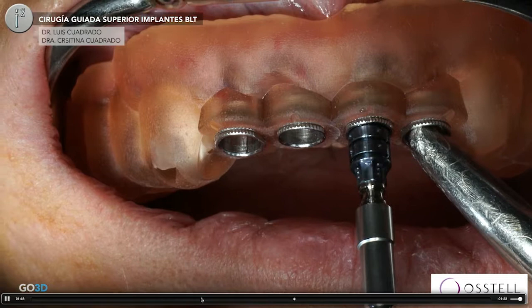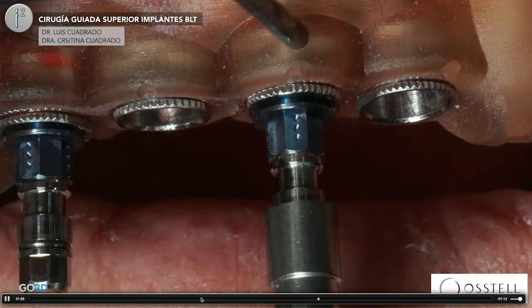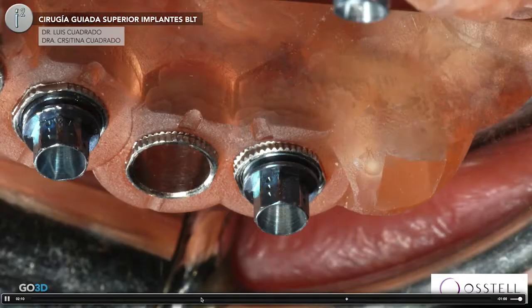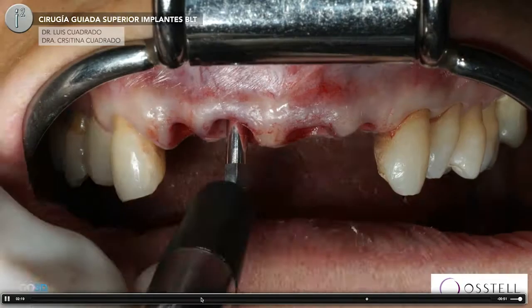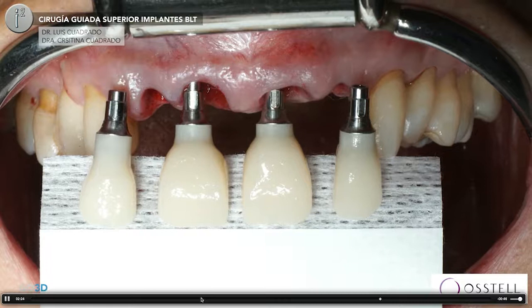I need to stop my insertion just with the slot. If I'm able to match that, it is incredible because when you are reaching that point, it becomes stiffer, it becomes really hard. Now I need to take my ISQ values of my implants to be sure I have enough ISQ value to start my immediate loading procedure in both implants.